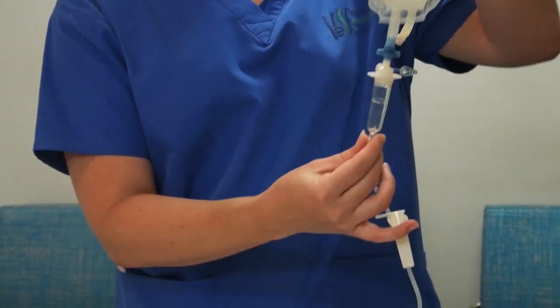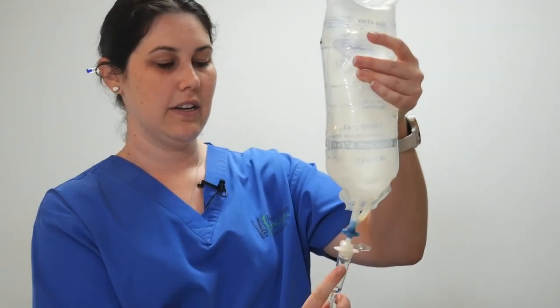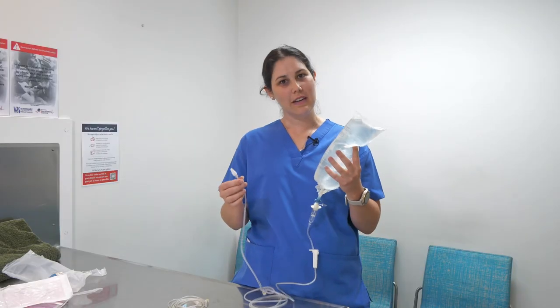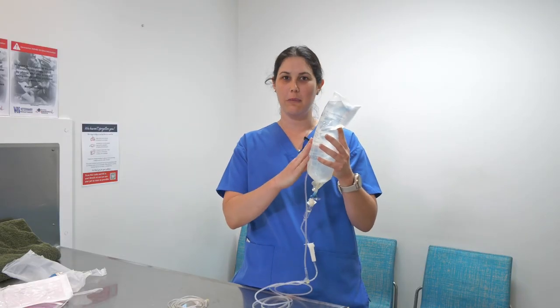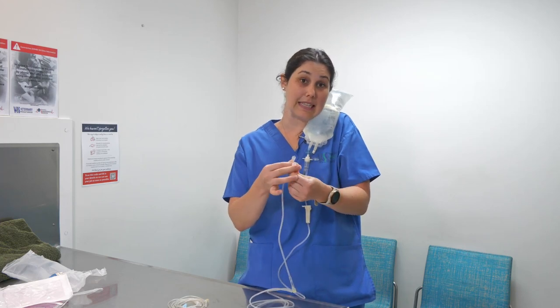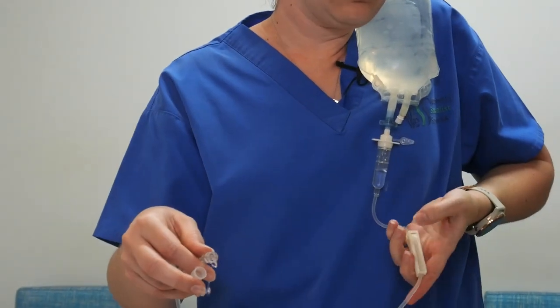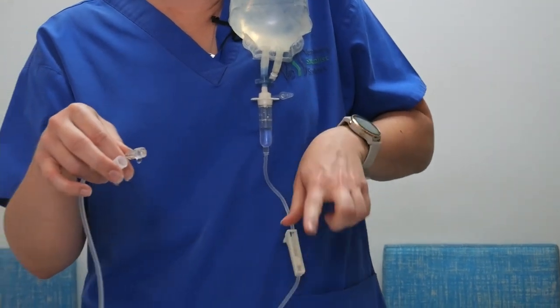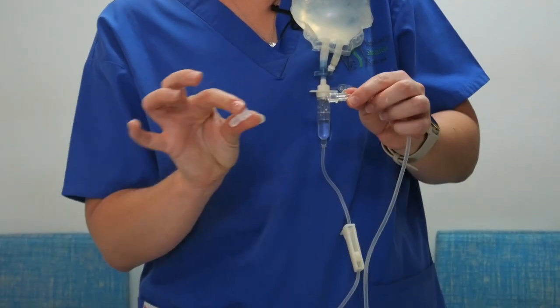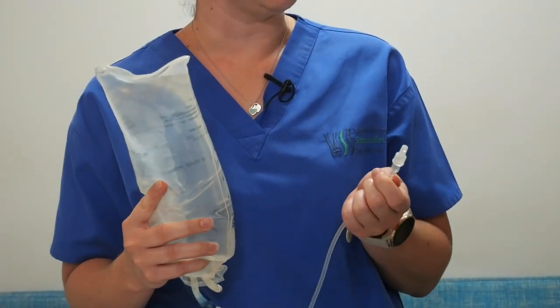Then we turn our bag upside down and give this little chamber a slight squeeze to fill it with some of the fluid. We want to flush the fluid from the bag all the way through the line. I usually pop it on my shoulder and rest against my head to keep everything nice and clean. We give it a little flush so the fluid comes through, then use the roller and clamp down so the fluid stops. We can then replace the cap on the end, keeping it clean and ready for next time.